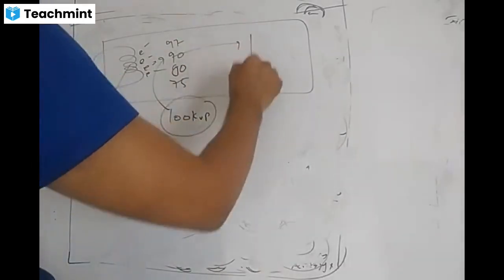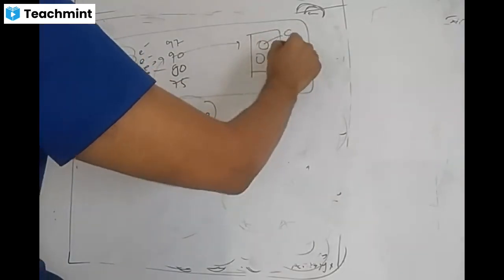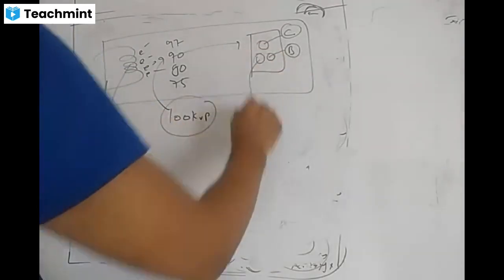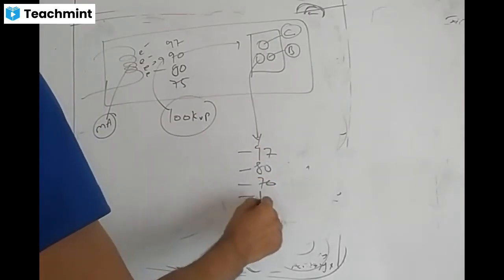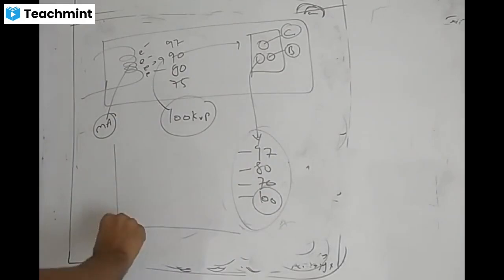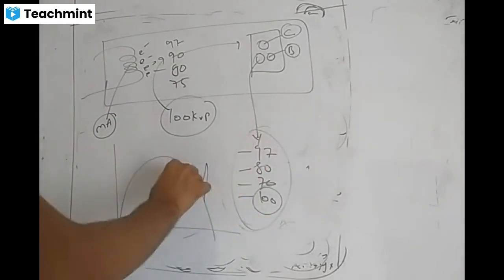They moved towards the anode. Then collisional interaction, Bremsstrahlung interaction. Then what comes out? X-ray. Some X-rays 97, some 80, some 70, and very few 100. Different energies. And if we draw the graph, the X-ray energy spectrum looks like this, with some peak.